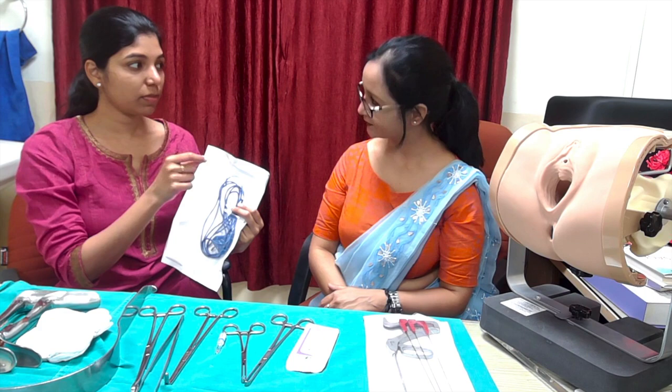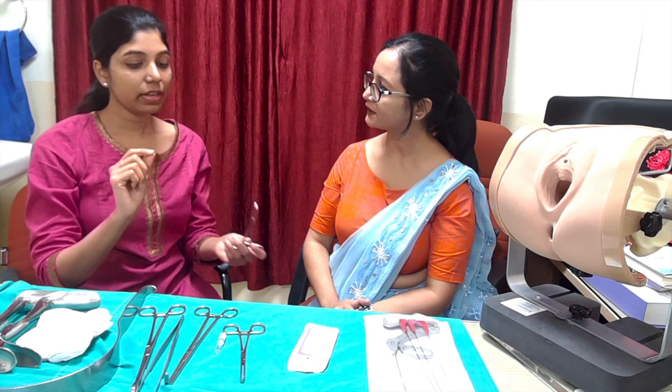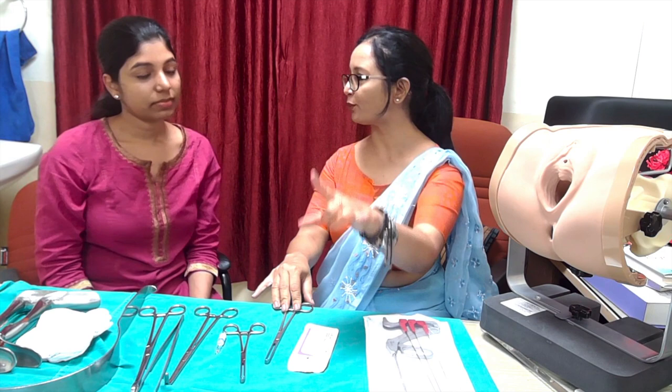After hydrodissection we use monopolar cautery to incise the middle one-third of the posterior vaginal wall. We hold the vaginal wall edges with two Alice forceps, then very slowly use our finger to develop the plane. Initially you need to cut a few fibers with sharp scissors to enter the plane, then you can advance with blunt finger dissection.